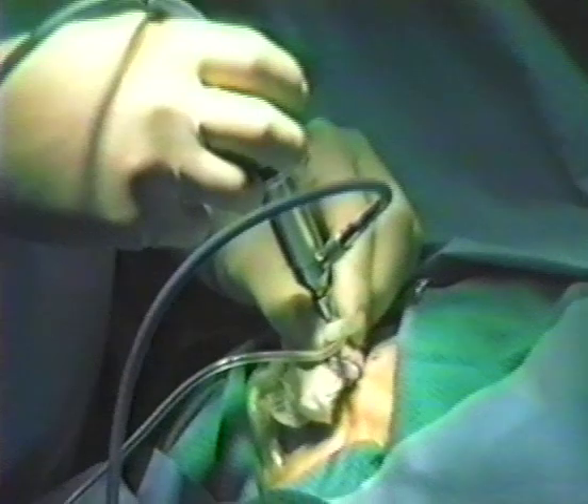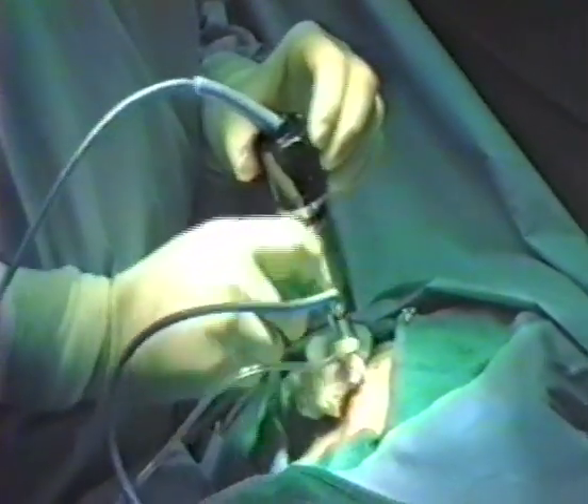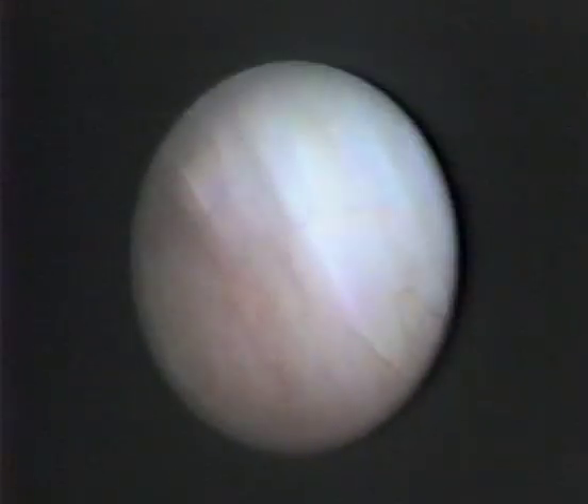Following removal of the trocar, the arthroscope is inserted and the camera oriented to present an anatomically correct image. Once within the joint space, the meniscus and the vascularized retrodiscal tissue can be appreciated.